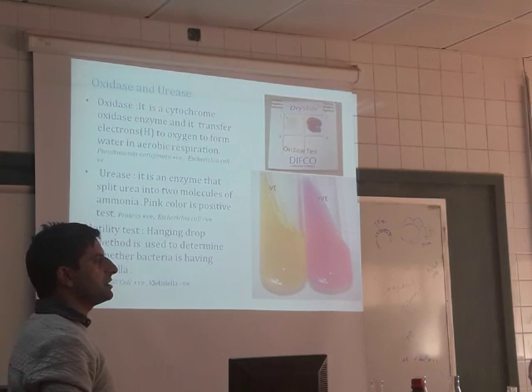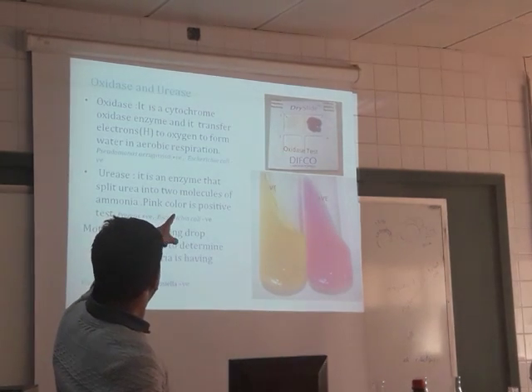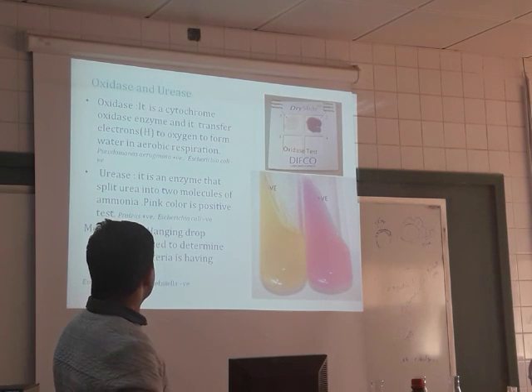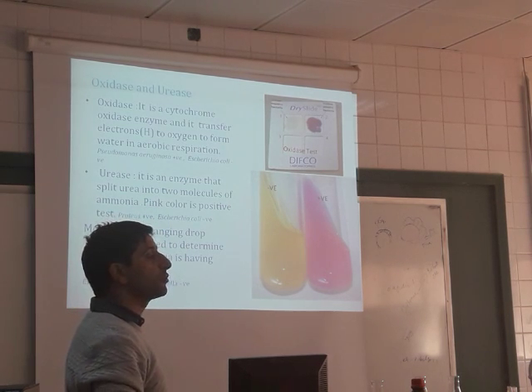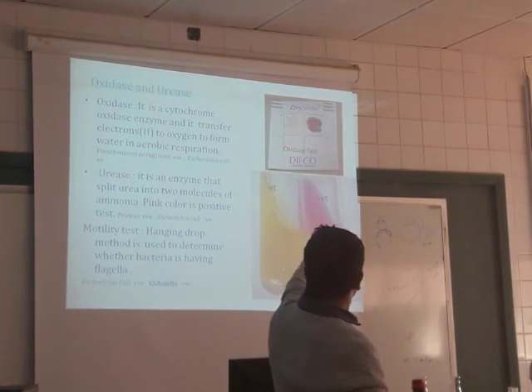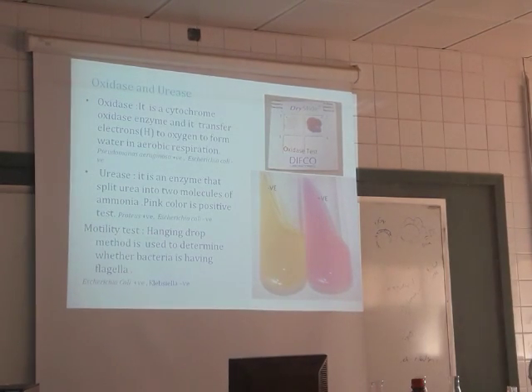Oxidase. Oxidase is also an enzyme, a cytochrome enzyme. It transfers electrons to oxygen and forms water if the microbe uses aerobic respiration. Okay? And it turns blue in color upon the reaction.